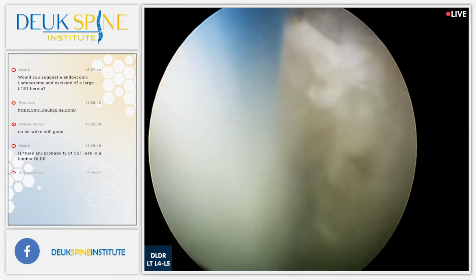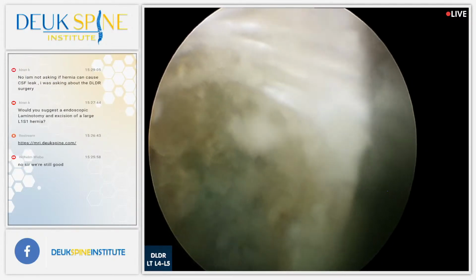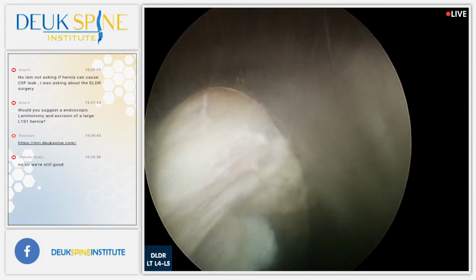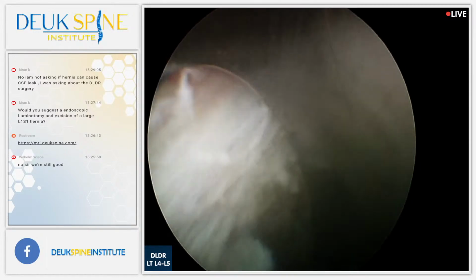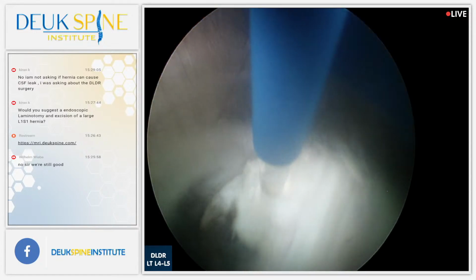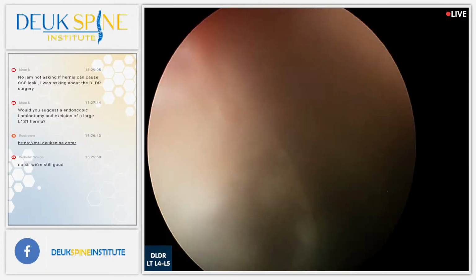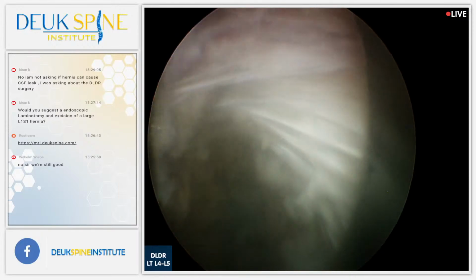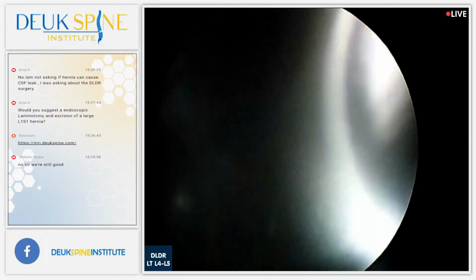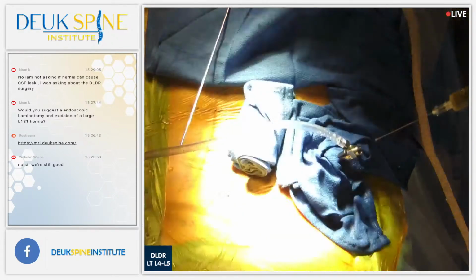All right, this should be it right here. I'm pretty much done. Let's take a look. There's the nerve. Actually, there's a tiny little piece right there, let's get that. I think we're a bit overexposed, but it's fine. It's fine at this point. Thank you. Thank you, Luis. Yeah, we're done. Great job, everybody. So we're done here at L4-5. We're going to do the DPR next on his facets.